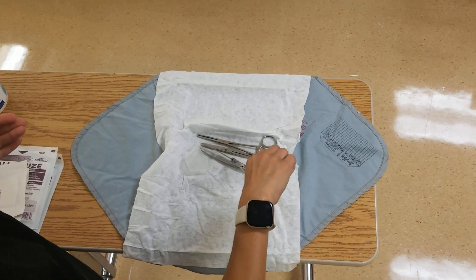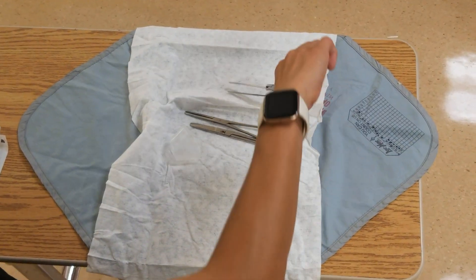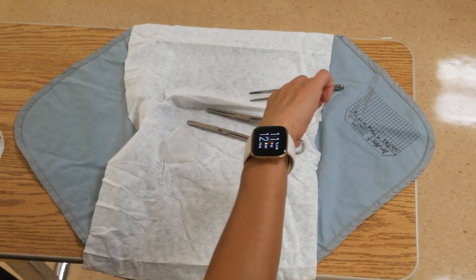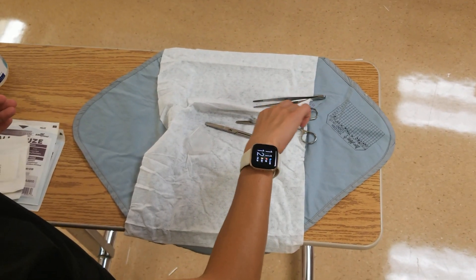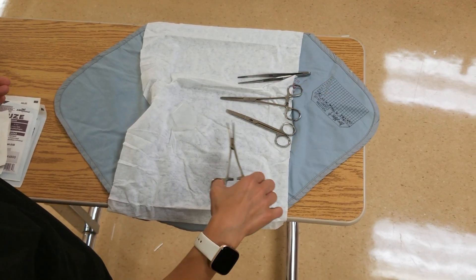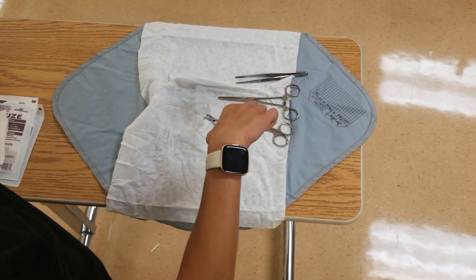The other items in the kit are the forceps. They're a lot more sturdy because they are re-sterilized and repackaged. There are two different types of forceps, and then you always have scissors, which is really handy if you're cutting packing strips.